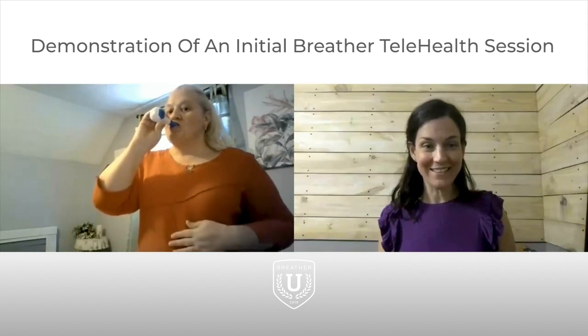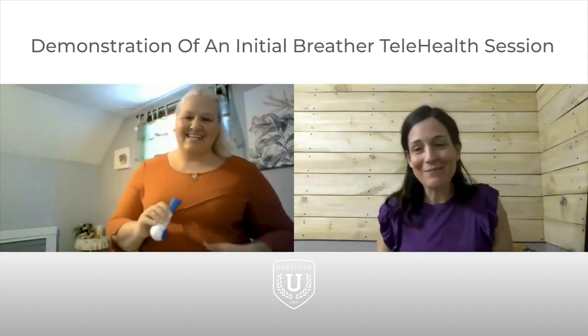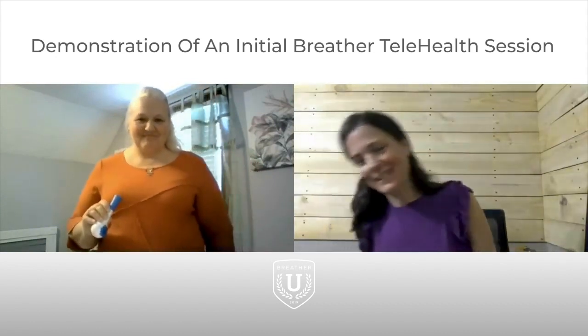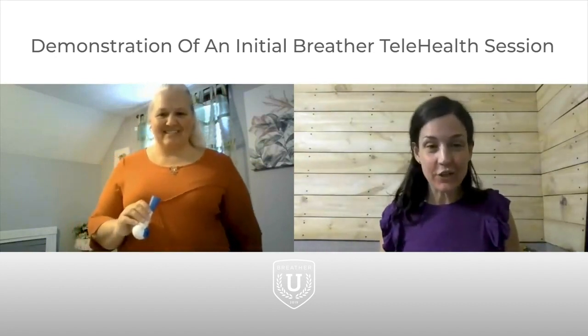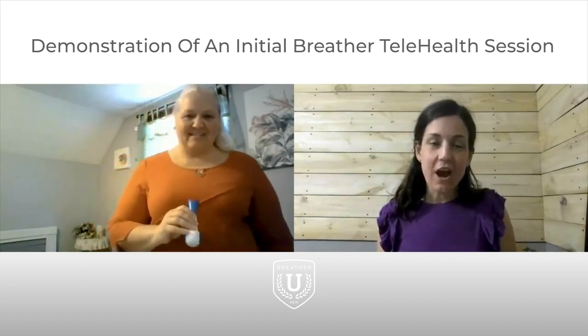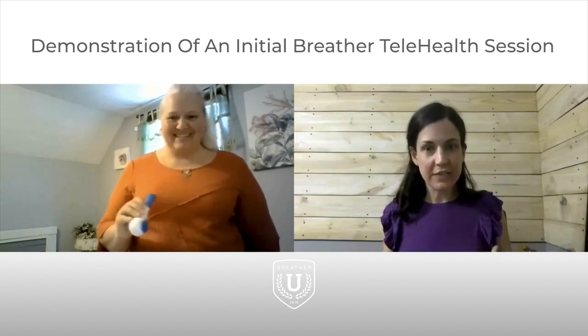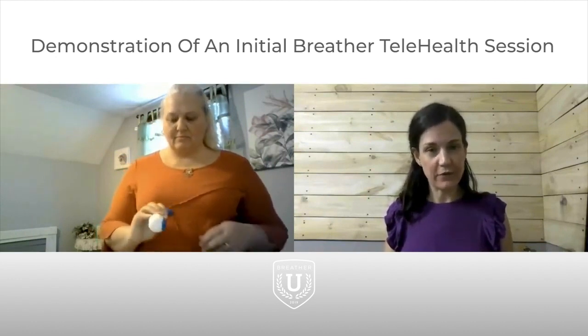Did you do 10? Sorry, I wasn't counting. I'm the worst at keeping count. Oh, boy. Well, that sounded good. Did you get out of breath at all? I'm done now. It was more of a challenge. Are you lightheaded? I'm not lightheaded. Okay. That's a good challenge right there then. You did it, you felt it, but it didn't make you out of breath or lightheaded. So we'll stick there. That's where I want you to leave your numbers for now.